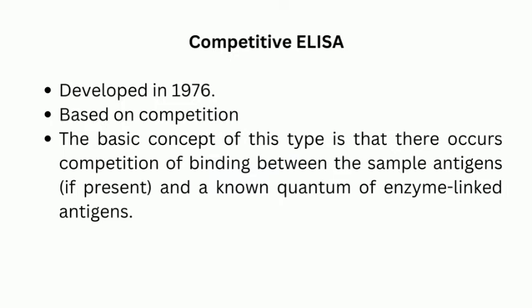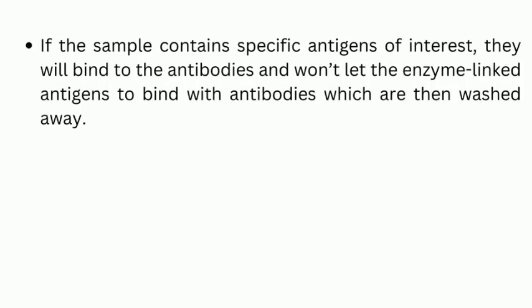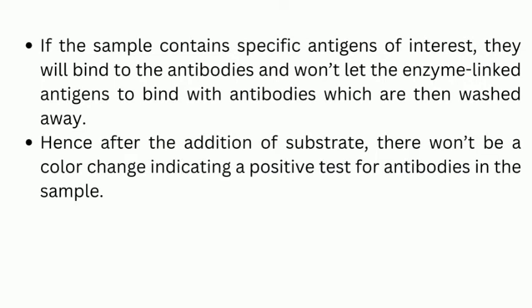The basic concept of this type is that there occurs competition of binding between the sample antigens if present and a known quantum of the enzyme-linked antigens which we provide. If the sample contains the specific antigens of interest, they will bind to the antibodies and won't let the enzyme-linked antigens bind with the antibodies. So then they are washed away, and hence after the addition of substrate, there won't be much color change, indicating a positive test for antibodies in the sample.